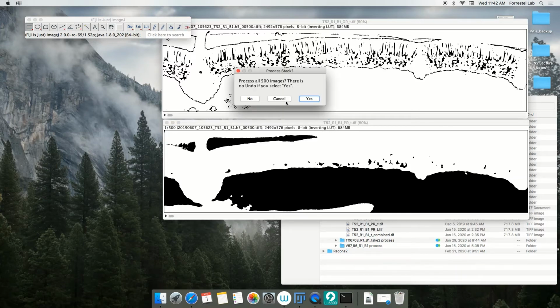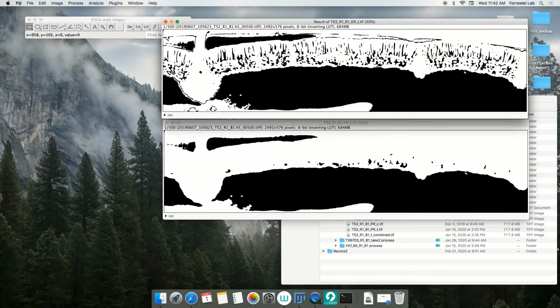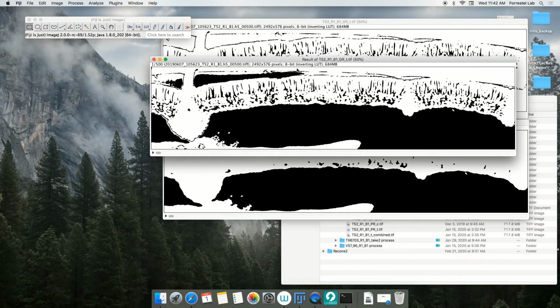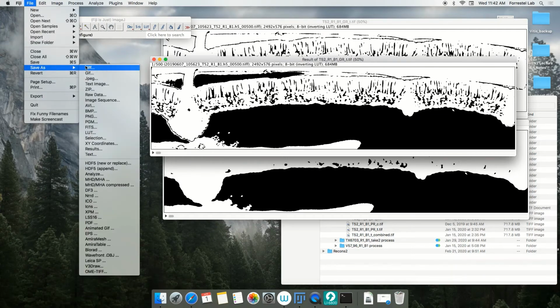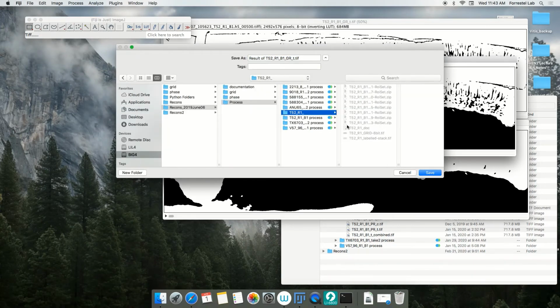You should have pretty quickly an added image. This is going to be what we will use in the auto segmentation program, and so make sure to save it as whatever the naming convention is currently. And that's great. You're now ready to move towards individual slices and segmenting those.